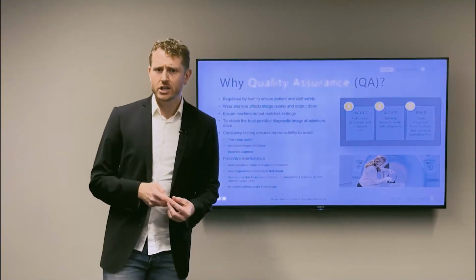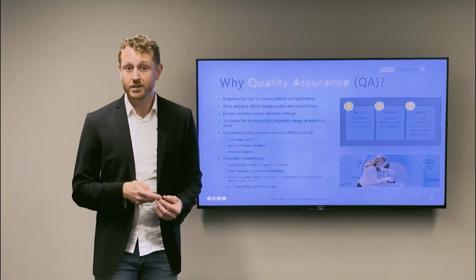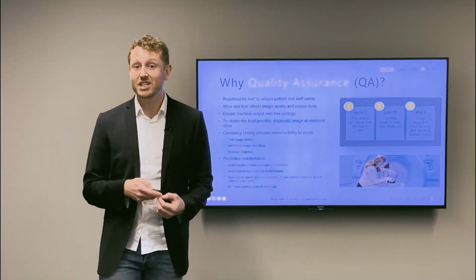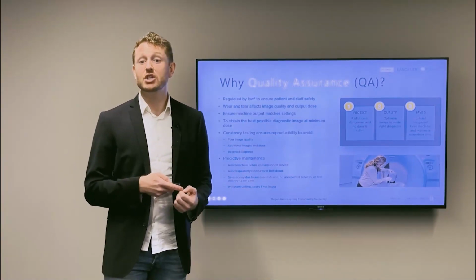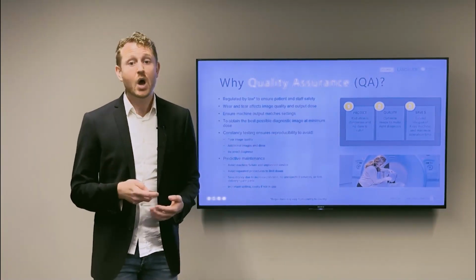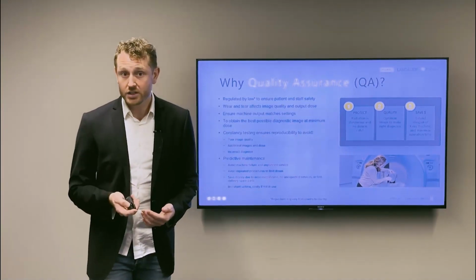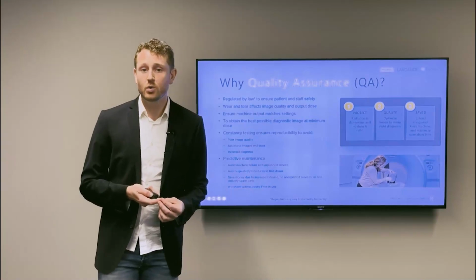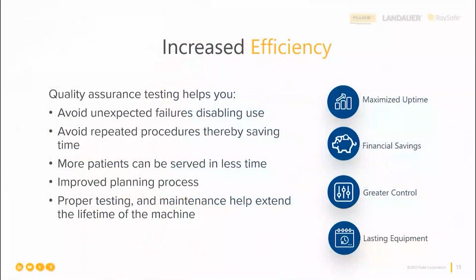Making sure that the X-ray machine's output is consistent over time is of great importance if one would like to minimize patient dose. One should always strive towards getting as good image quality as possible without giving the patient unnecessary dose. The advantage of the exposure must always be greater than the potential risk. Before we continue further with patient safety, I will linger a few more minutes on the economical point of view.